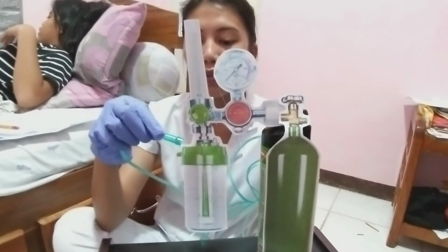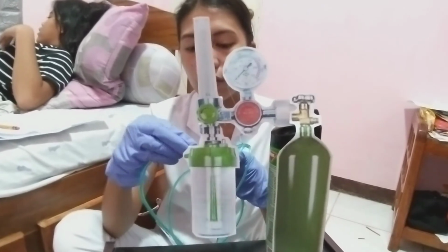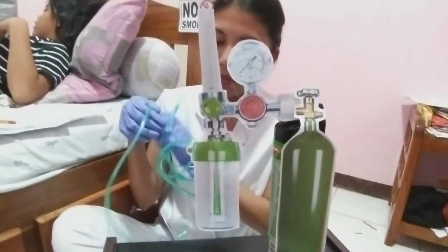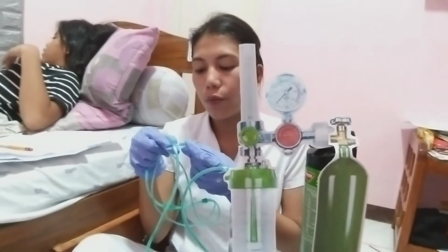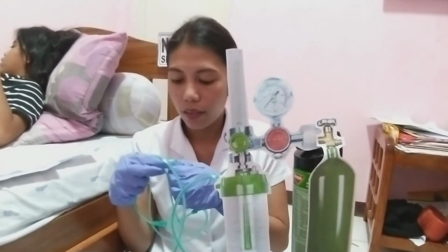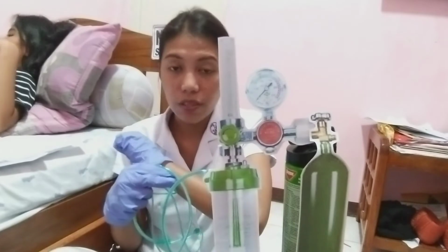Then connect the tubing onto our humidifier or flow meter. So now it is connected. For us to be able to identify whether the gas is present, we can check it by feeling it with the back of our hands or our skin.